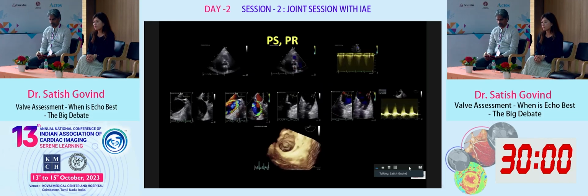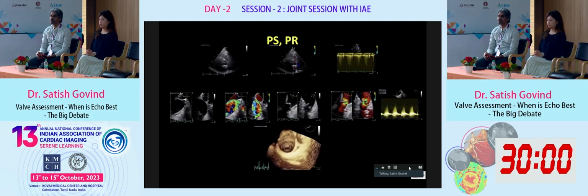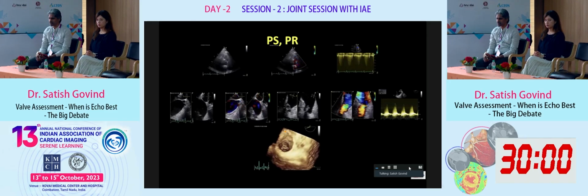Now, the pulmonary valve, as Dr. Jahan mentioned, echo is still the first line and still provides a lot of information. But because of the complexity of the interventions and sometimes the windows can be a problem, it's one of the most difficult valves as far as echo is concerned. So very limited views, but when it does provide information, it provides fairly accurate information.